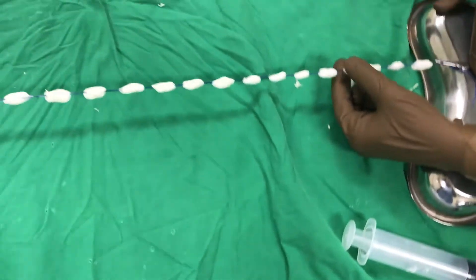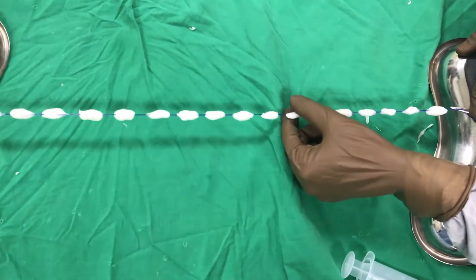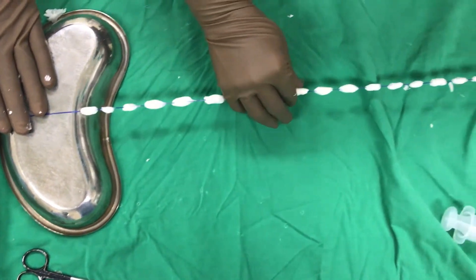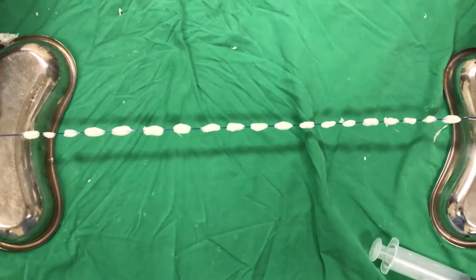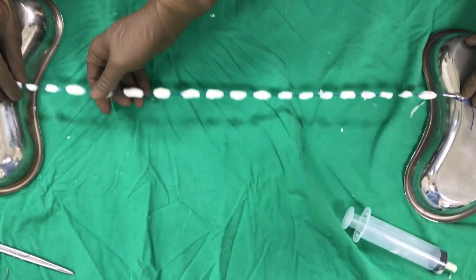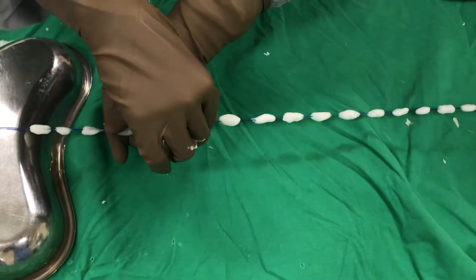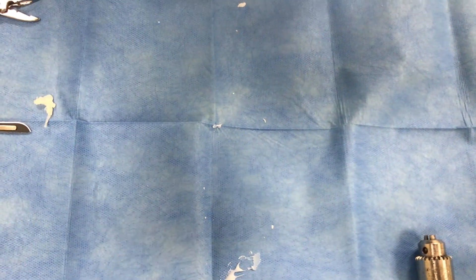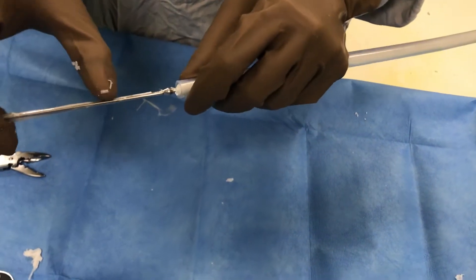The beads are almost ready. We can play along with them a little more — make them firmer and more rounded so they don't fall off; we still have time. As the cement is starting to settle down now, this is the time to score the chest tube. It's a good time to score the chest tube and get the cement rod out without damaging it.